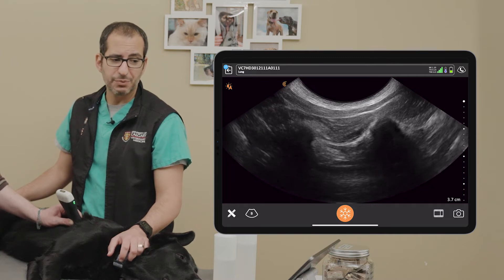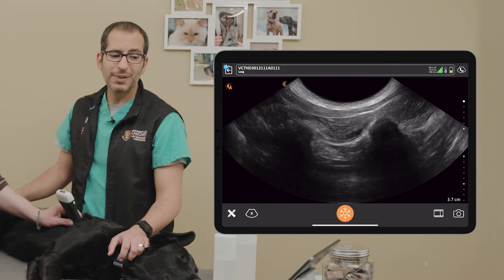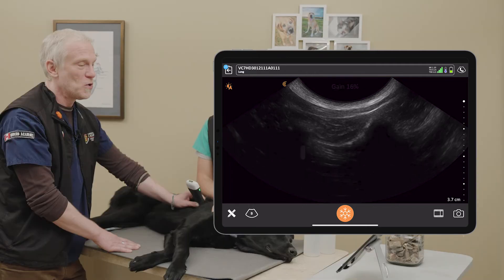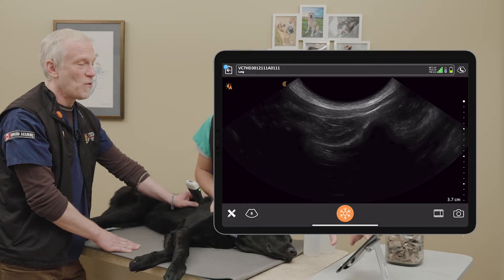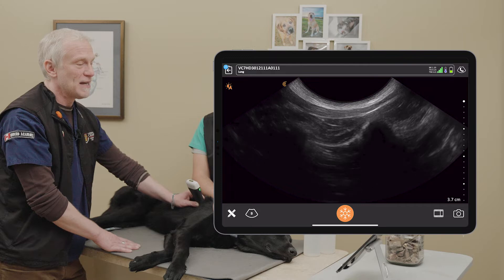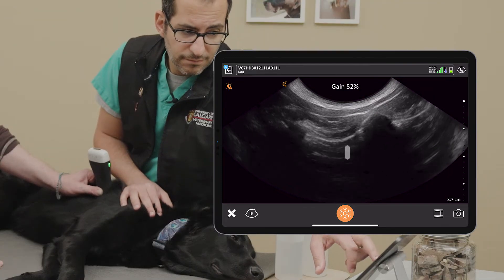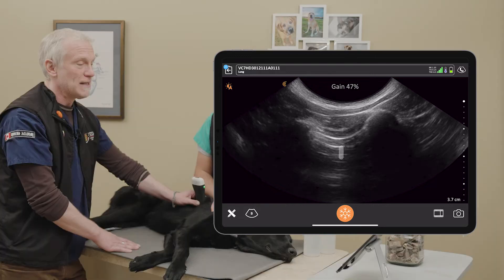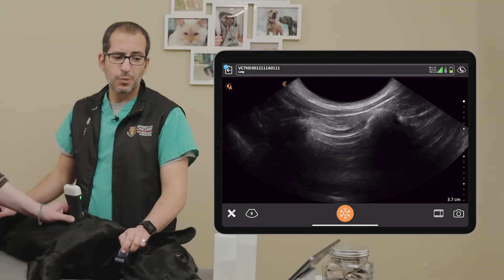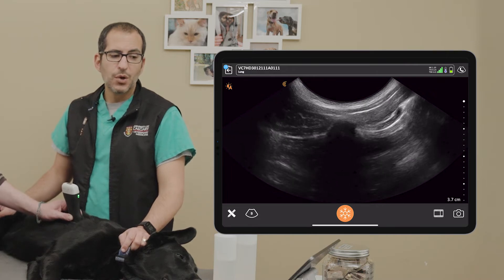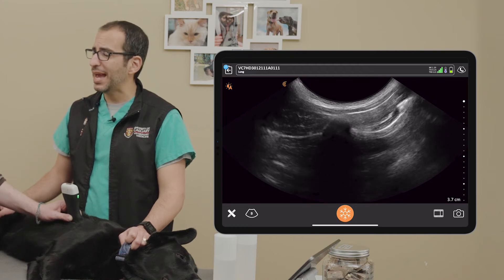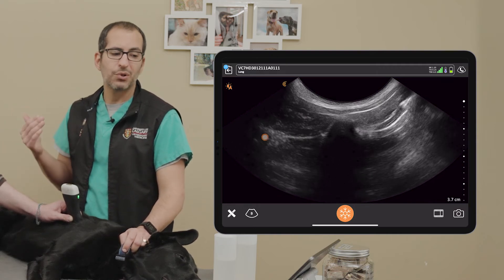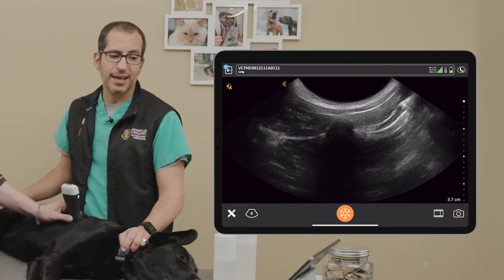Other tricks of the trade: we can play with the gain. Simply drag your finger across to decrease the gain, and we see the shimmer again. We can also situate the probe over one rib instead of between two ribs — we love to call this the dead bat sign, because it looks like a dead bat upside down with its wings played on either side. This changes the angle of insonation over that pleural line, makes it more grainy, and allows us to see that lung sliding much better.